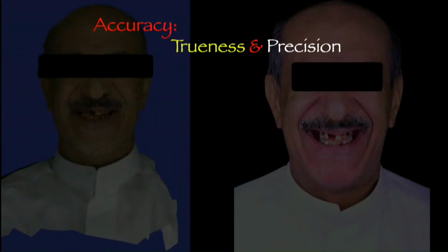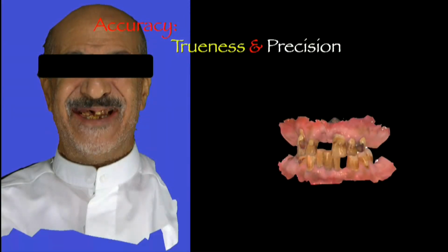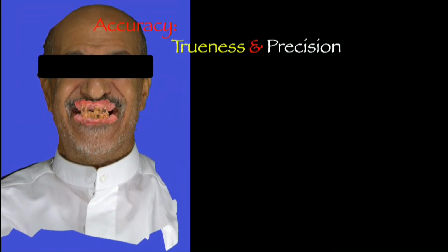We still didn't talk about merging the data from our intraoral scanner, which is the whole point of doing that, especially in the implant field. This might be very beneficial for the orthodontic field, but when we're talking about the implant arena, it's a different ballgame. Again, the whole purpose of this is basically to merge our findings from an intraoral scanner to the facial scanner. Now, we really need to understand how that merging process works.